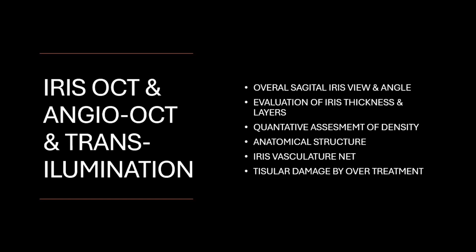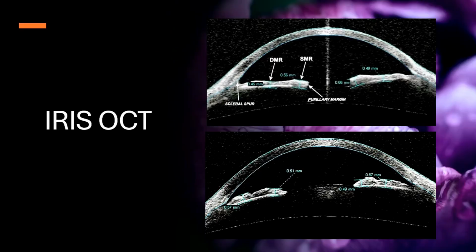Angio-OCT will provide us with a comprehensive and detailed idea of the current state of vascularization of each individual iris after carefully performing a certain number of laser treatment sessions. And finally, transillumination is a very useful technique for detecting areas of the iris where the posterior pigmented layer has been destroyed, which, as we all know, should not be removed, since it ensures protection against ultraviolet rays.